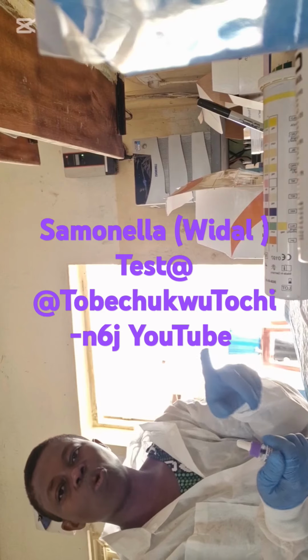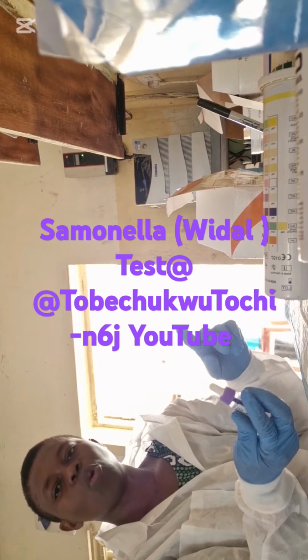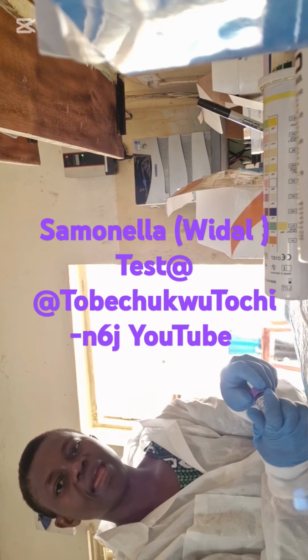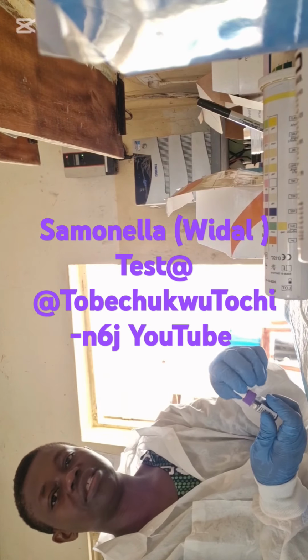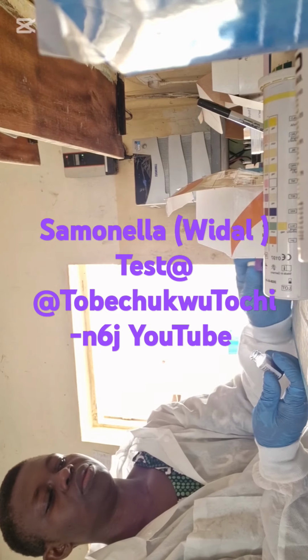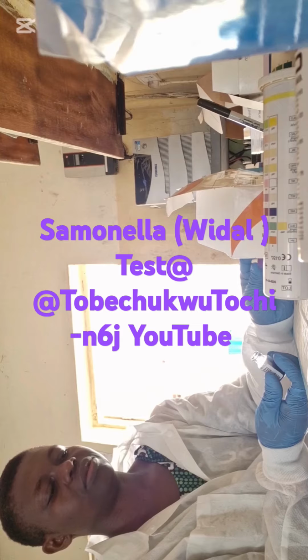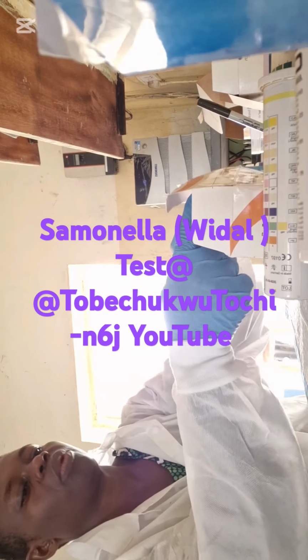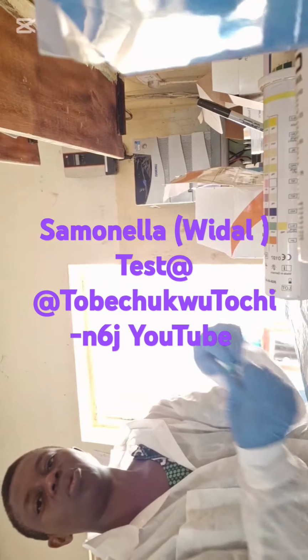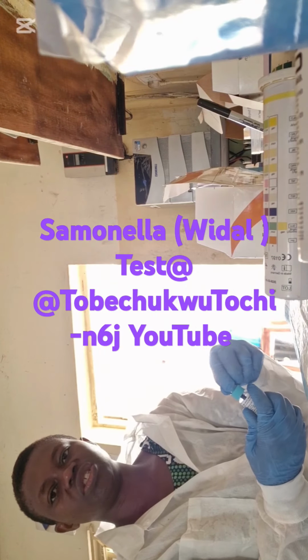After it, we'll now add the whole blood. That is the plasma from the whole blood sample. The whole blood, in the sense that the blood has been put into an EDTA container. Then spin it, or allow it to stand for some hours to get the plasma.